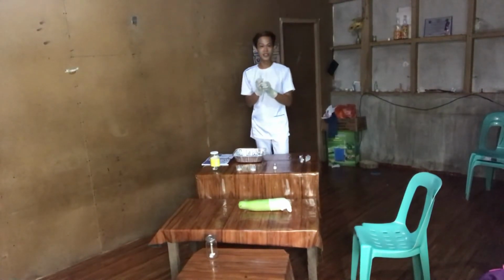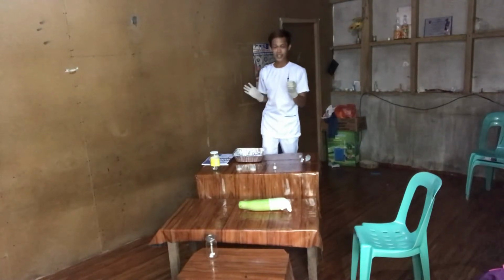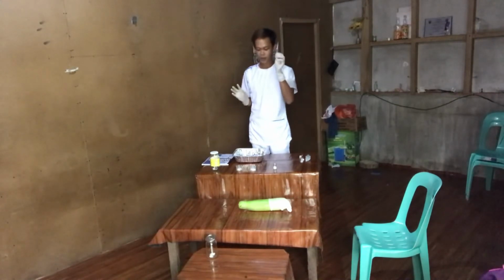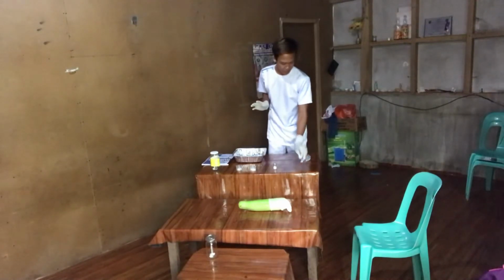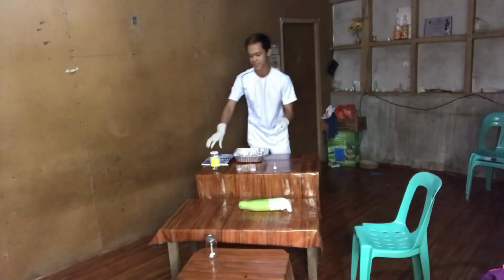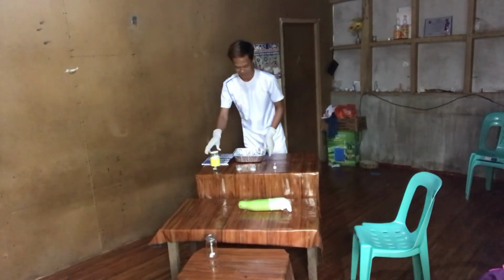I'm going to place it in the hypodermic tray and discard the used aspirating needle into the waste receptacle. At the same time, I'm going to put all of the things for waste disposal in order for us to observe cleanliness.